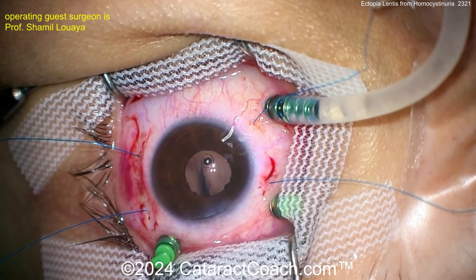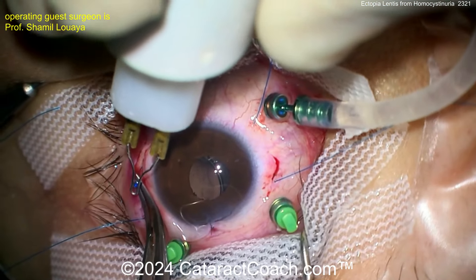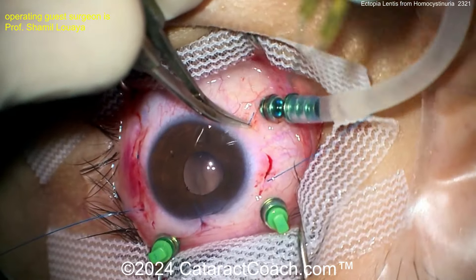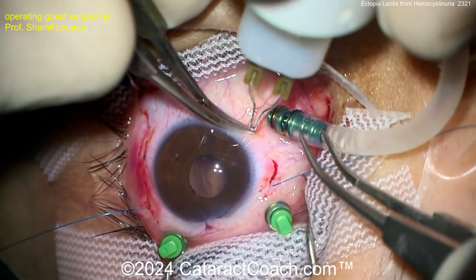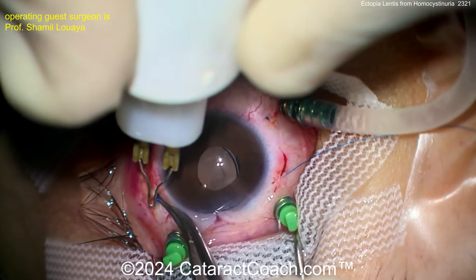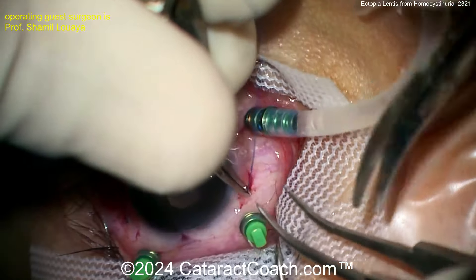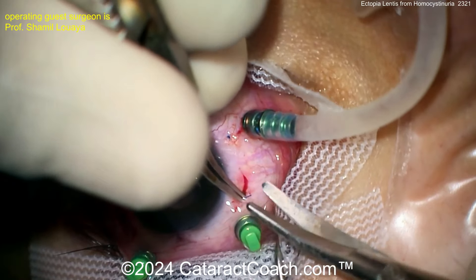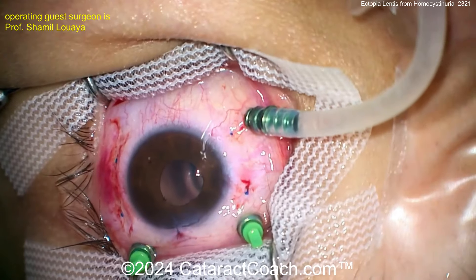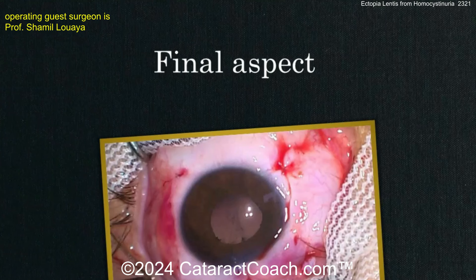Now slowly tighten up all the suture material — don't pull too hard, as you can damage the lens. Little flanges are being created on all four sides. When creating these flanges, make sure they are really tucked within the sclera. You don't want a big knot, bulb, or prolene sitting just outside the conjunctiva — it will erode through. The surgeon is being very careful, cutting the sutures short so the flanges are not too big, then burying them within the sclera for a good long-term result.